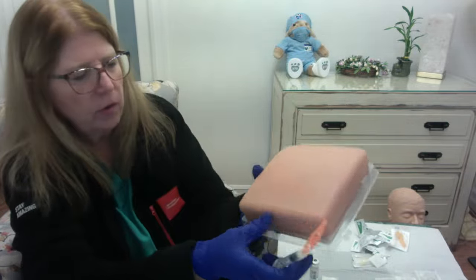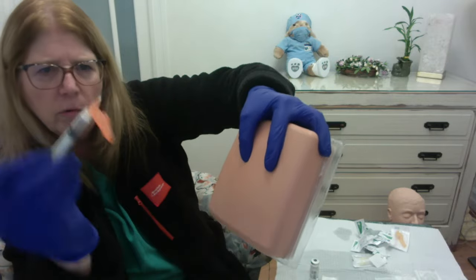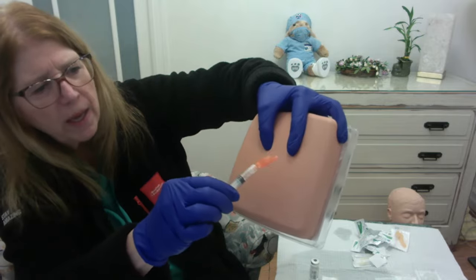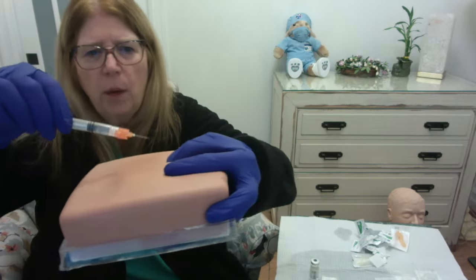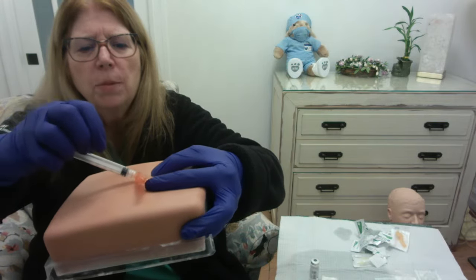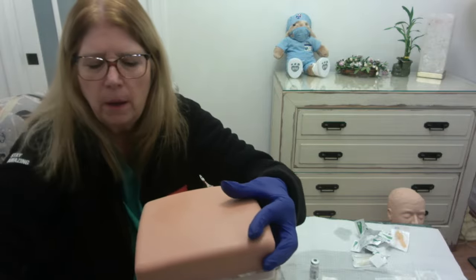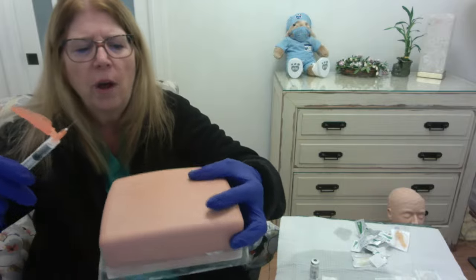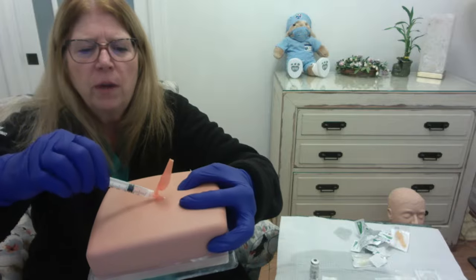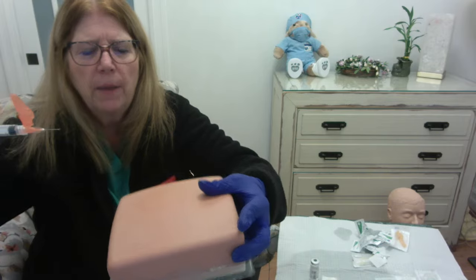So we have this. I'm going to pinch up that skin. Okay, and let me make sure where my bevel is. There's my bevel. I'm going to go in at 45, let me go this way. I'm going to go in at a 45-degree angle. I'm going to push the plunger, release the skin, pull out the needle. Okay, you got that? So one more time. We've pinched up the skin, bevel up, 45 degrees, push the plunger, release the skin, pull out the needle.